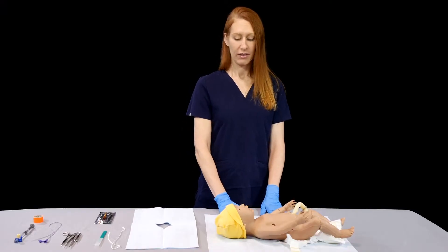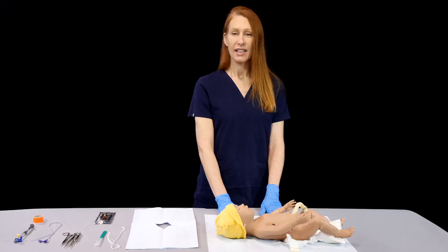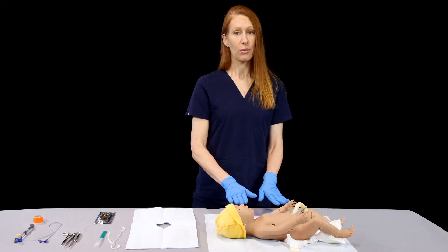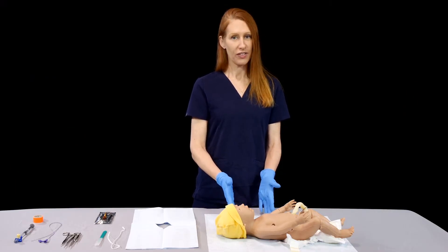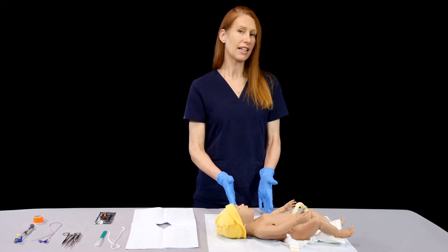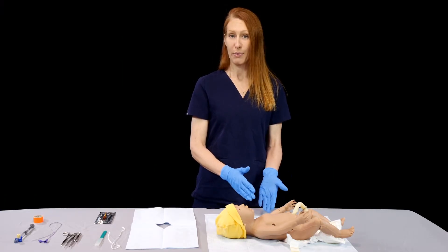We have our baby — in spite of the lovely yellow hat, she is actually critically ill. This is a procedure that we can do up to somewhere around 10 days. There are sources that say 14. I haven't had a lot of success after a week of life, and the earlier on the better.